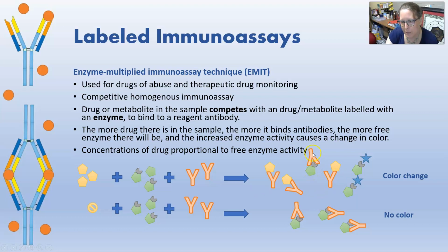If the antibody binds on it, then it prevents the enzyme from acting. So if there's a lot of drug in the sample, it will soak up all of these antibodies and leave the labeled antigens from the reagent free to react and cause a big color change. Okay, so a lot of drug in the sample, a lot of color change happens.